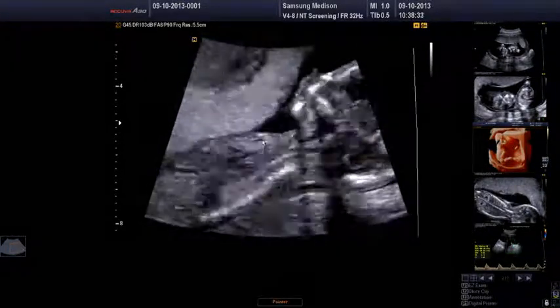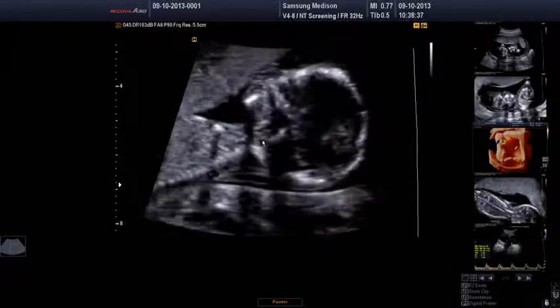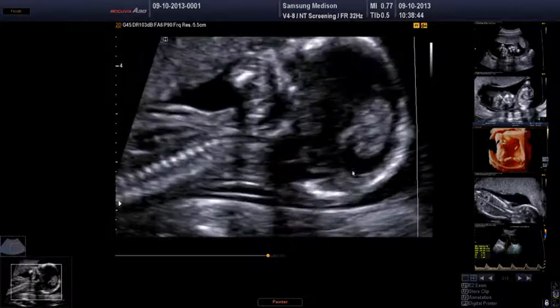Other markers for aneuploidy, obviously nuchal translucency. Now, this looks like the nuchal region here. I've got a reasonably large image, so I've got the fetal head and thorax here. Ideally, from a dynamic perspective, I'd just want to see the fetus jump up and down a little bit so we can make sure that, firstly, we're in the right area, and secondly, that when the fetus is moving away from the posterior wall of the uterus, the nuchal isn't enlarged.